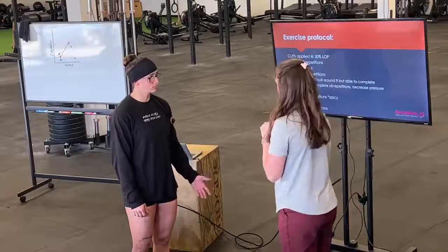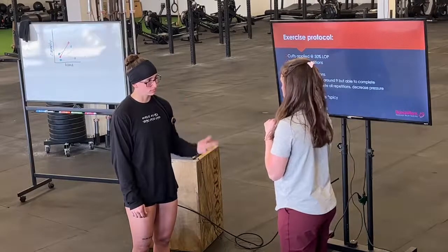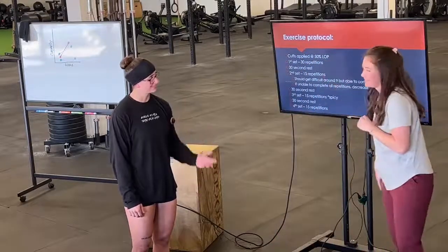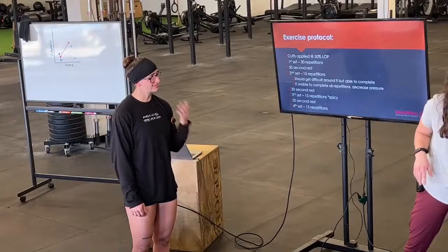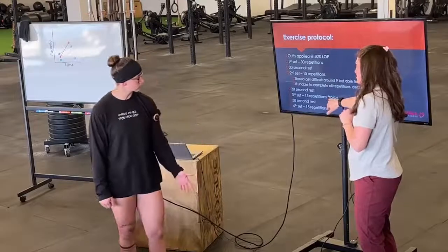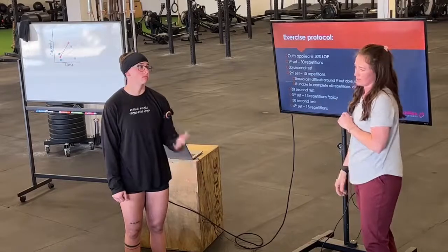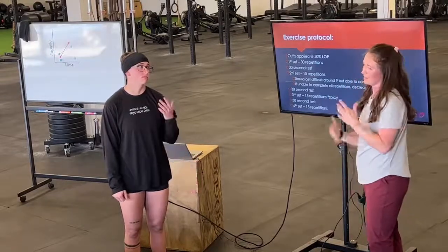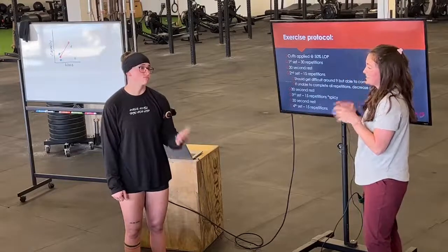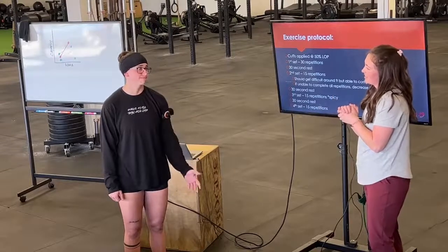So all you're gonna do is go from end range extension all the way through your range of motion to do a bicep curl. Yep, 30 times. Now, just count. Will you count to 30 when she finishes? Perfect. If I get to the second, and definitely by the third set, and she's not fatigued, I will load it a little bit. So I'll give her a dumbbell. Again, it doesn't have to be like a 35-pound dumbbell, but something light, just to further the load a little bit. How you feeling?